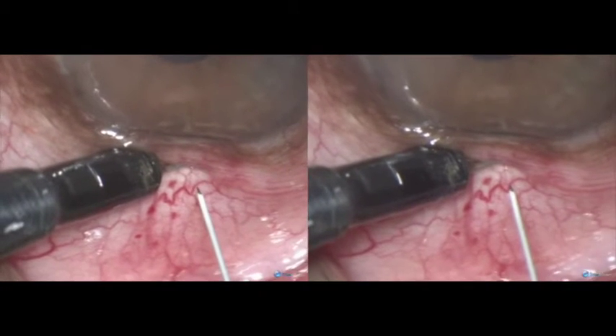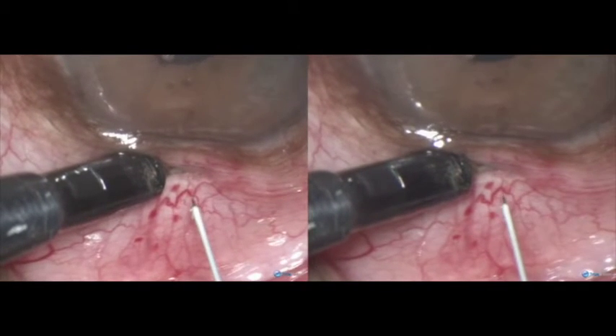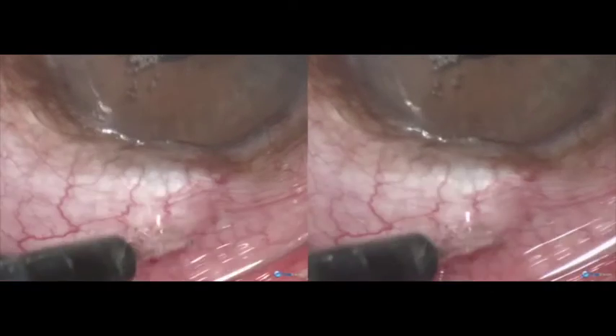Here is the tip, at medium energy. You just touch it, and the track is made. Another one is made, and a third one is made.